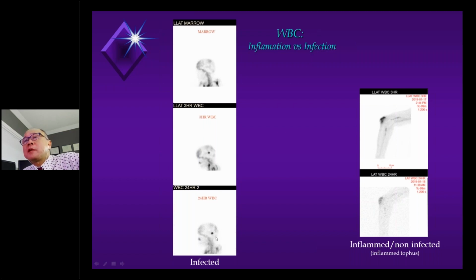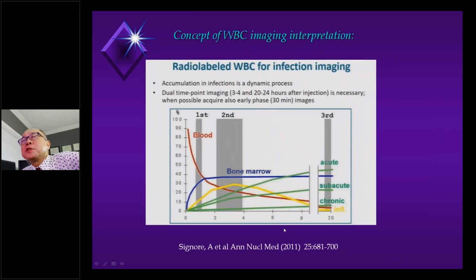And oh, by the way, I forgot to mention one thing, apologies. I just want to address one more issue. I don't think it's an issue, but the authors of this paper, for example, who promote this curve, will take this to an absolute in practice. With technetium, we are somewhat handicapped by the half-life of our nuclide, the 6 hours. So in Dr. Signor's department and in some departments in Europe, they will actually decay correct their planar images. So the requirement for this curve is absolute.